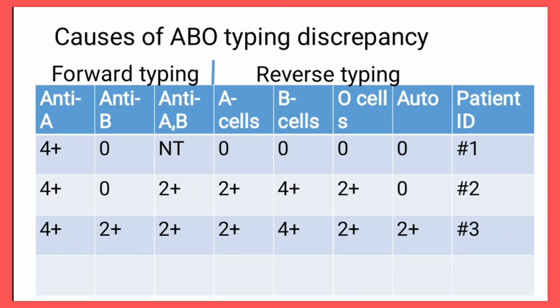Now, I told us the other time that when it comes to ABO grouping, and of course in blood banking, one of the things that can help you make a decision is the degree of the reaction. The fact that you have seen +4 confirms what is there, and it is more reliable than the ones that are weak.